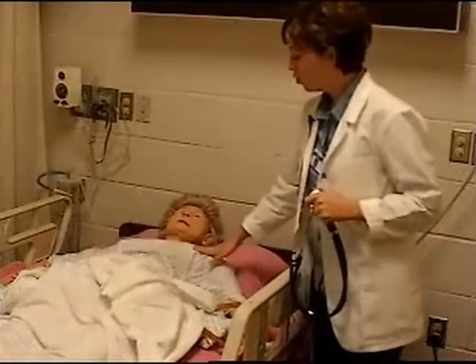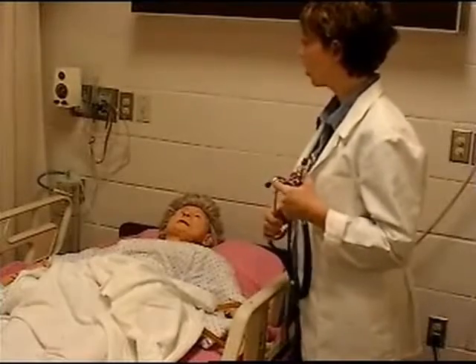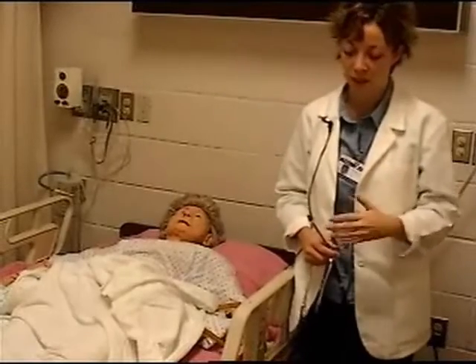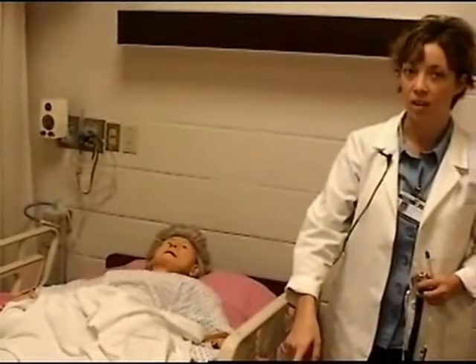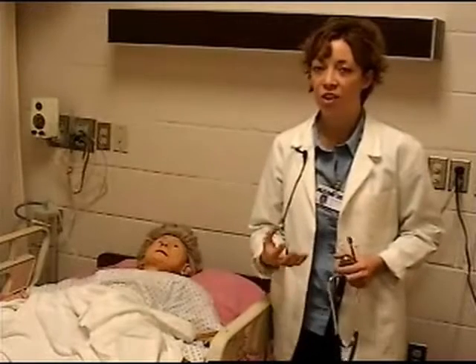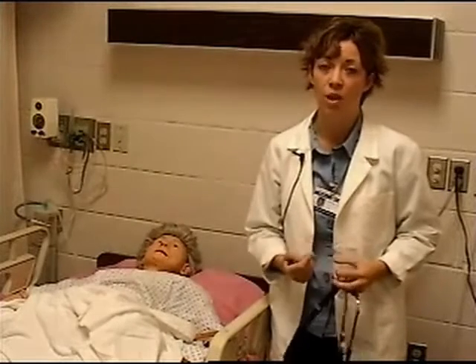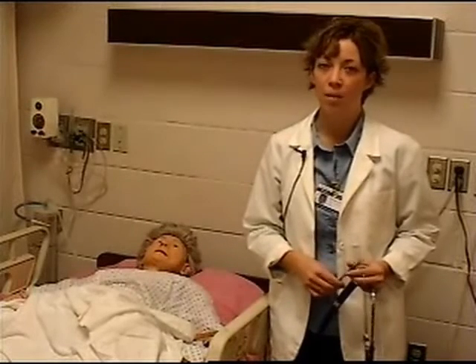So once you've done your assessment of your lung sounds, you can look at your suction and make sure that your suction canister is on. The suction canister, what actually determines how much suction is being pulled out of that chest tube, is where the water level is filled. And it states that minus 20 centimeters is for an average adult. If it's a pediatric patient or maybe an elderly patient, the doctor might do less suctioning for that. So you would have to look in the charting as to what the physician wrote for that placement.